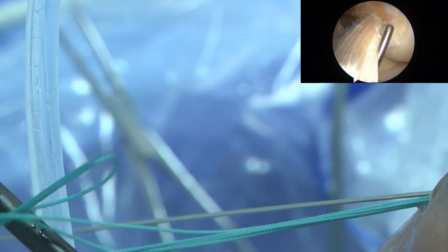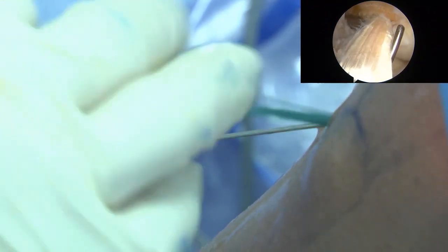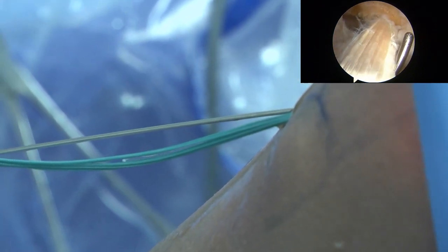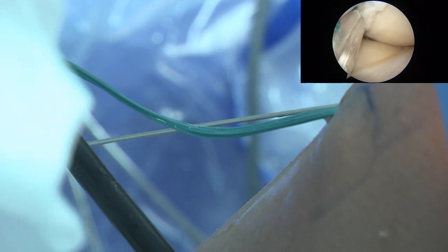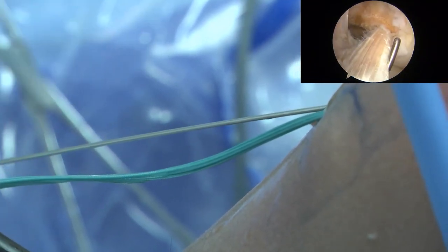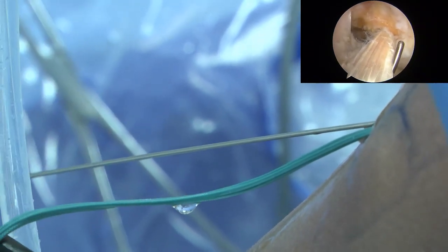The benefit of this, the guide behind the graft for the screw, is that number one, you get the longer tunnel. If you put the screw in the front, you get a short tunnel. You can imagine front and back, the length is different. Number two, the screw will push the graft to anteromedial, and your graft will be more oblique, because if you put the screw in the front, you put the graft to lateral, you can get the lateral wall impingement. Okay.